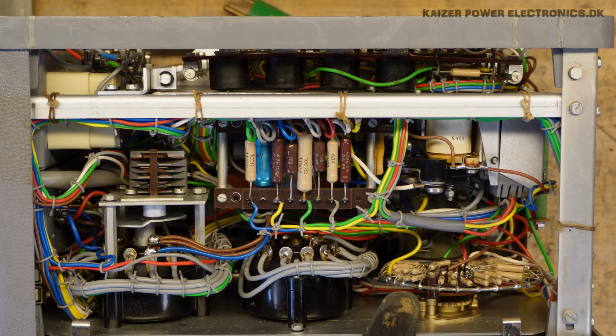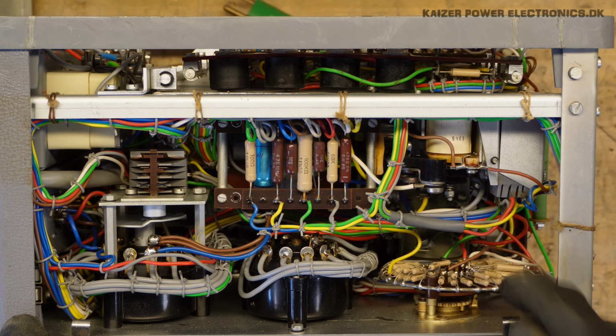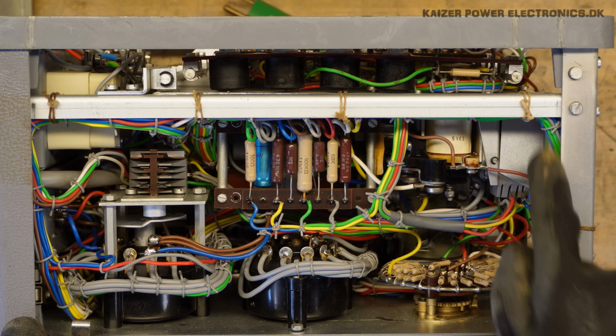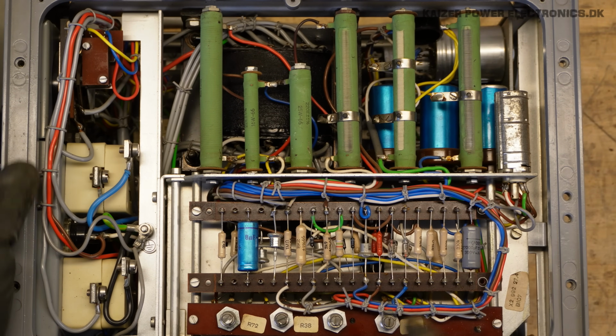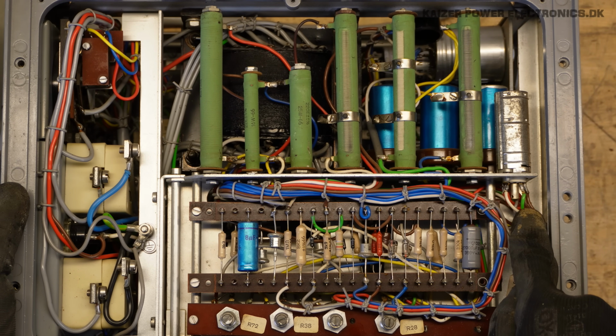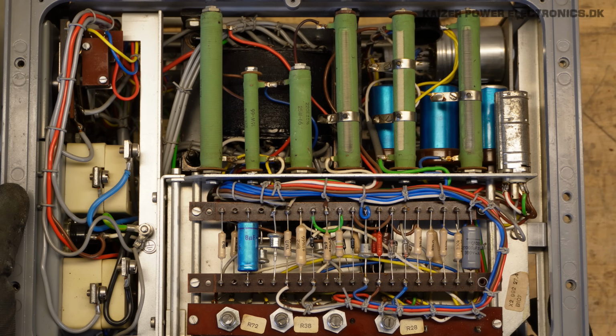Then over at the exposure timer we have a wheel of resistors into this multi-selector switch, which is quite a lot of steps. 1, 2, 3, and so on up to 21 steps. And this is without a doubt what most of the circuitry at the back is all about. We have all the colored wires sitting here. We have some relays sitting over here. And if we take a look at our power circuit here, again, all the circuitry and the tube, that will have to do with the timing circuit.